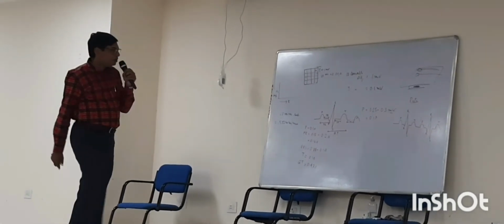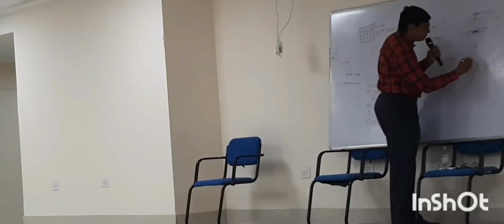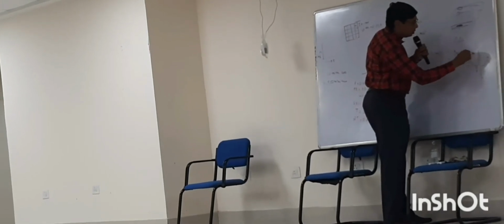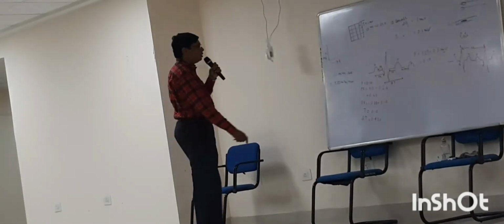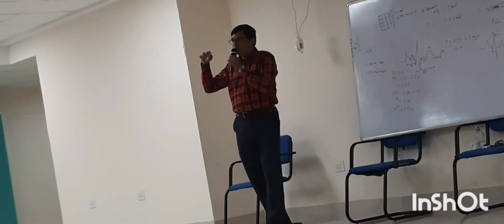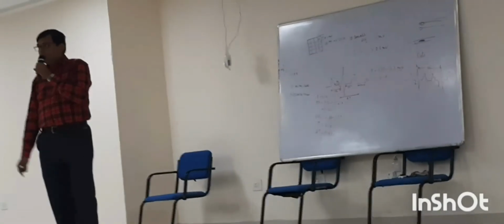Look at the board. These are two successive waves. If we consider two peak waves, two positive waves, as an interval, how can we calculate the rate? In 1 minute, the paper goes 1500 millimeters. So how many RR intervals are present in a minute?